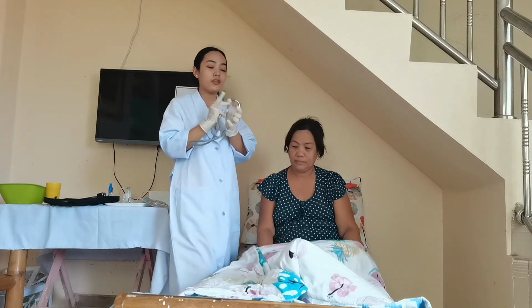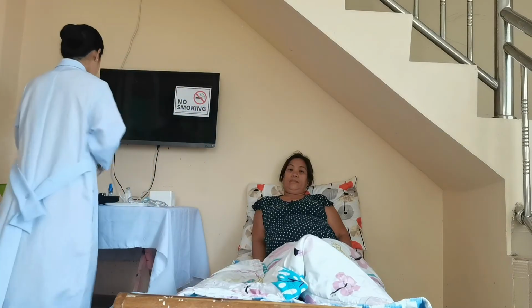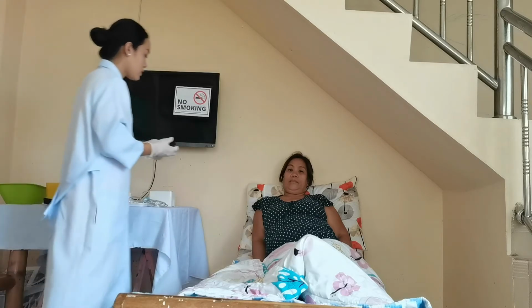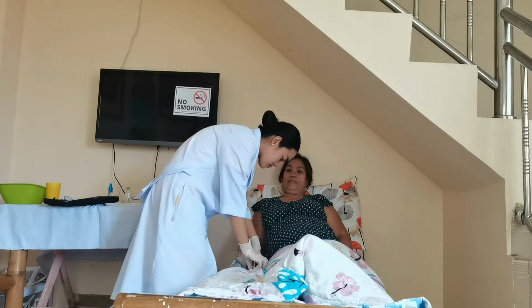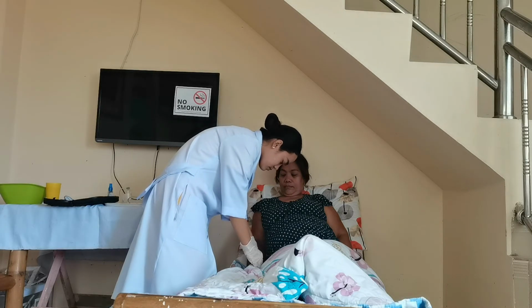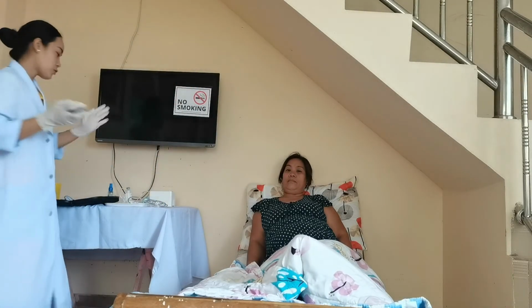Alright, so upon assessing the lung sound of my client, I noticed that there are wheezes upon auscultation. So ma'am, tingnan ko lang din po yung inyong oxygen. Checking the client's oxygen saturation, it is 94.